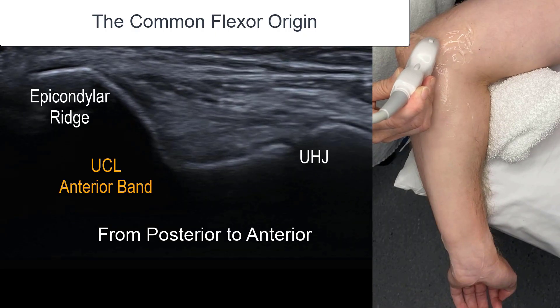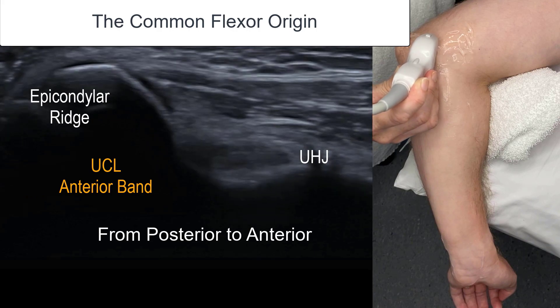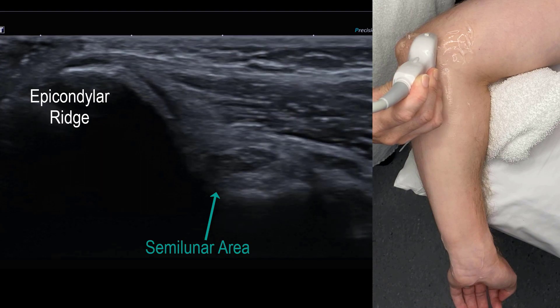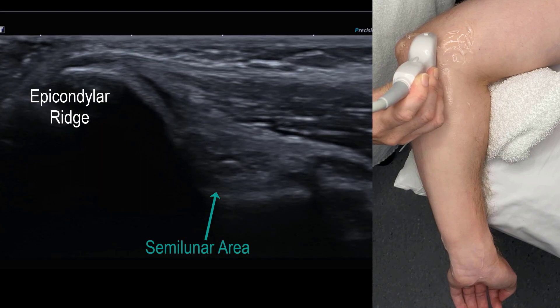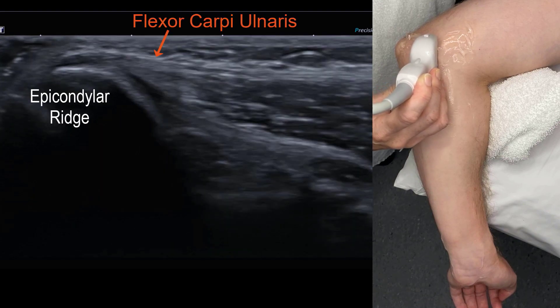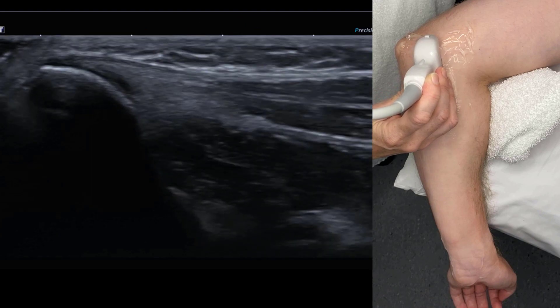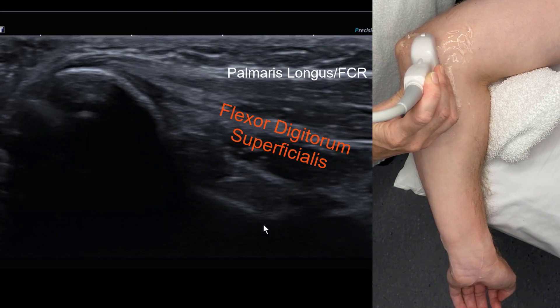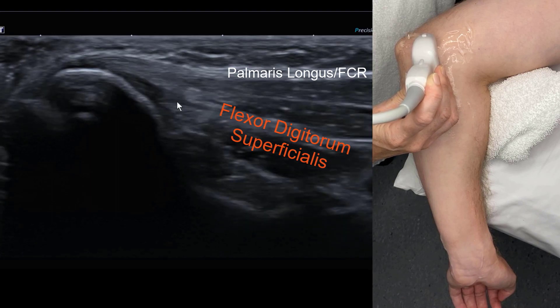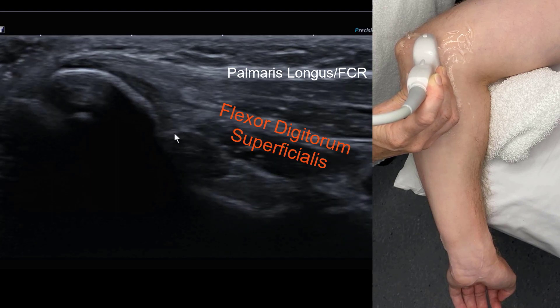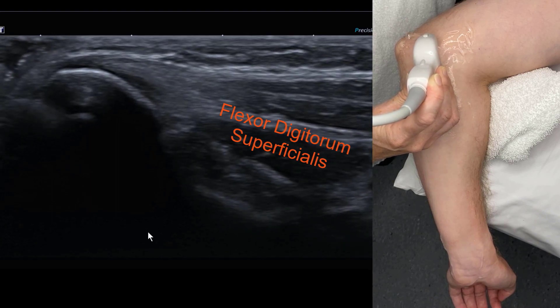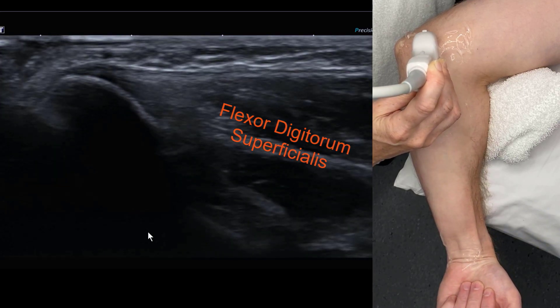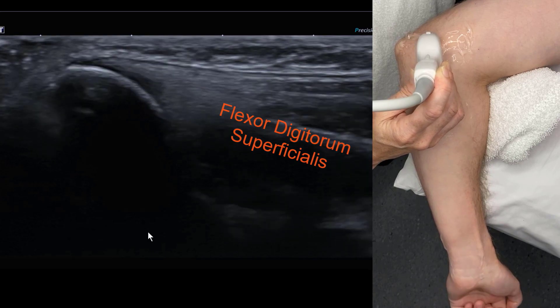If we're now in longitudinal but quite oblique, we fall onto the FCU just overlying this semilunar area, which is deep to the ligament — and there's the flexor carpi ulnaris. Then we move anteriorly and fall onto the central third of the common flexor tendon. At this point the tendon is quite layered, due to its multiple origins, but also because there may or may not be a palmaris longus tendon overlying.